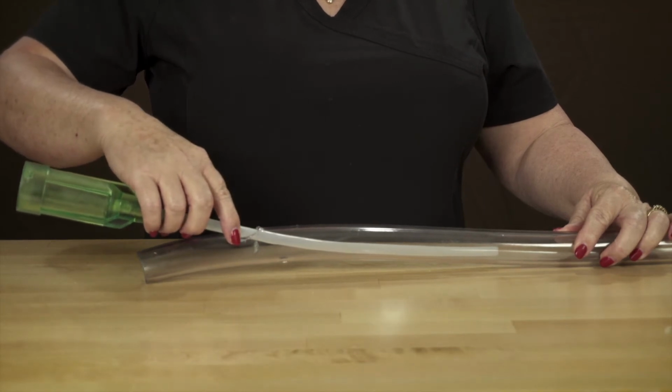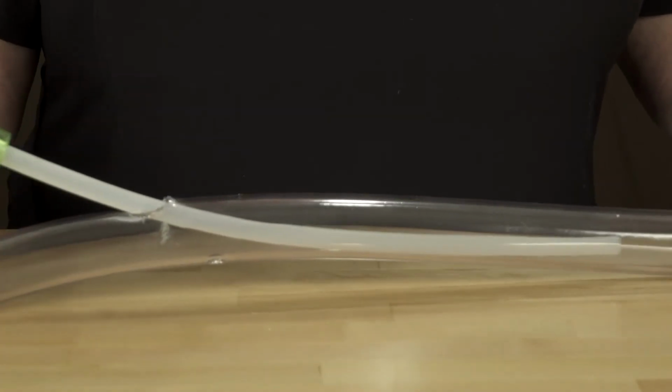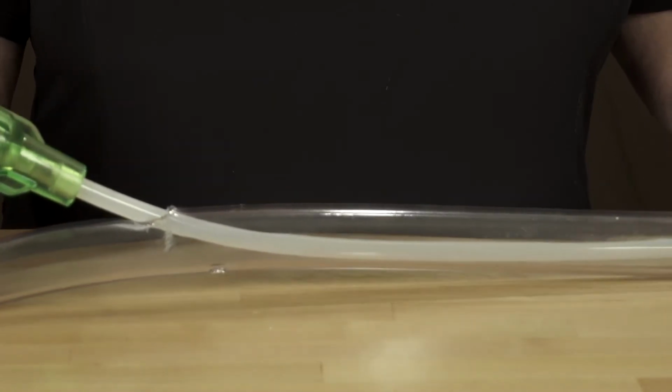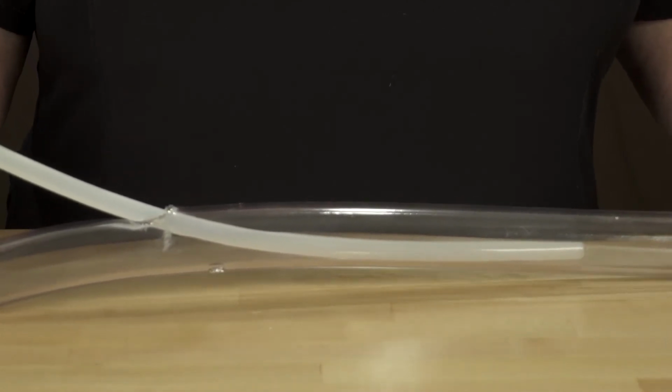Using this large catheter, move in and out of the vein to demonstrate lack of securement or placing at a point of flexion, where the cannula pistons in and out, pulling bacteria in and out of the exit site, as well as causing mechanical phlebitis along the vein.